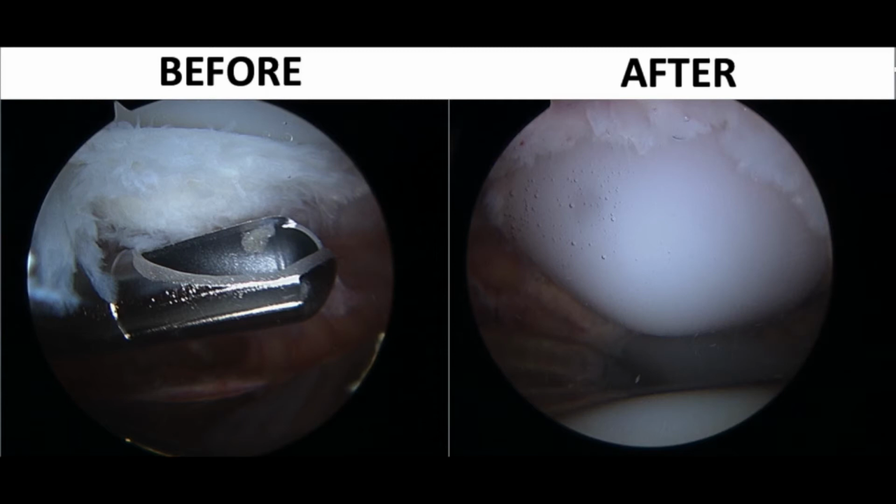In other cases, we find that there's wear on the polyethylene or the plastic. And I have another case coming up, and I'll show that. And when we cleaned it up, we found that the material that had been in there for 10 years was an older type design, and so that had started to wear. And so that was the reason why she was having the pain in that knee. And instead of redoing the whole knee, we just had to change the plastic. And we couldn't really diagnose that without doing the arthroscopy. So sometimes we also use arthroscopy diagnostically.